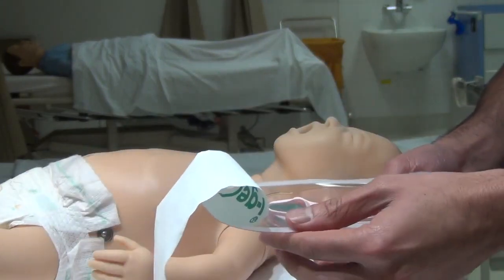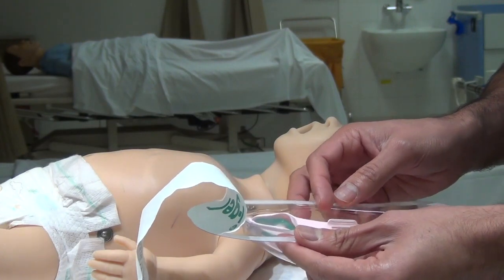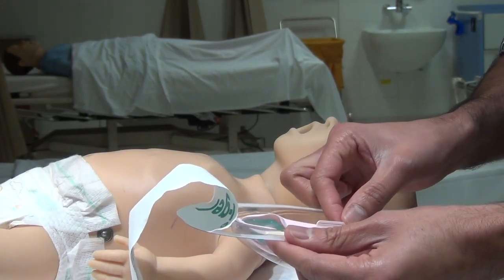Open the iGel pack. It's important not to leave the iGel exposed to the radiant warmer for too long, as the gel may soften and cause difficulties with insertion.